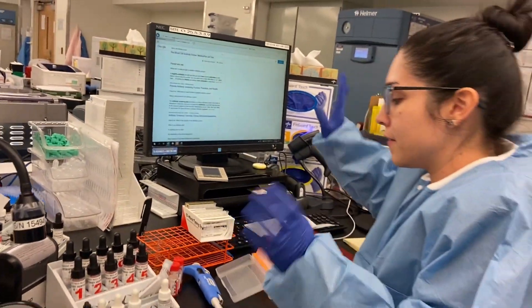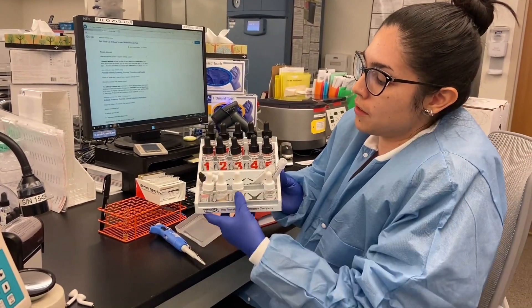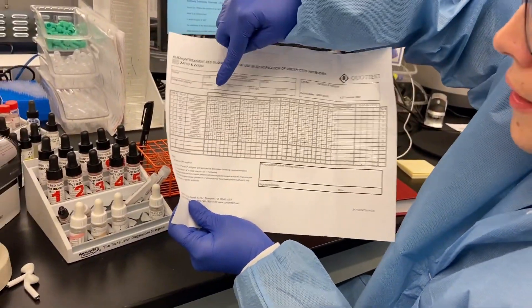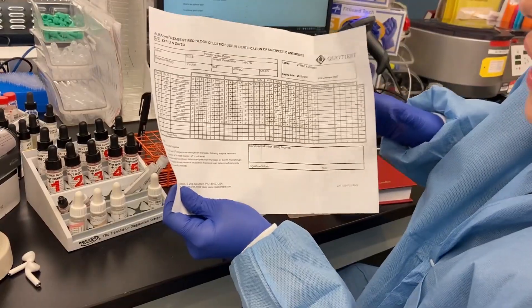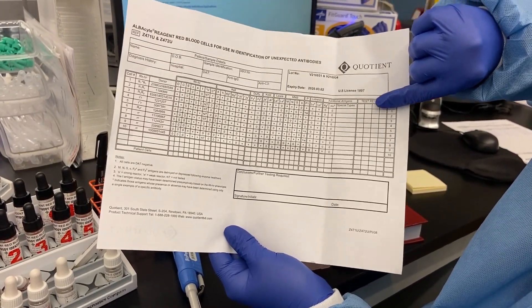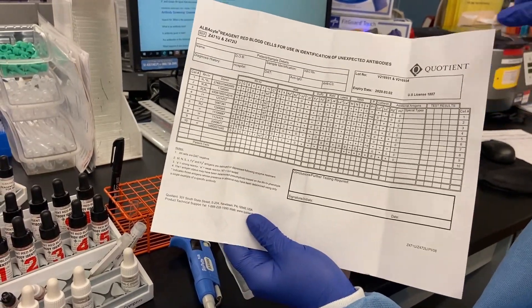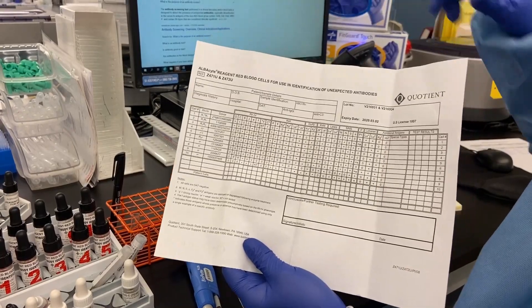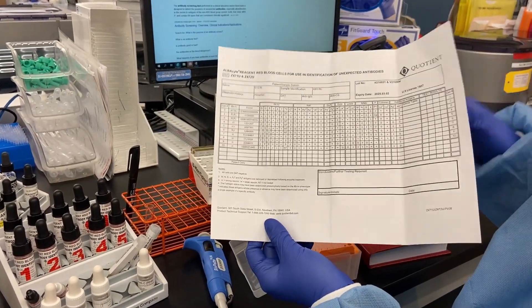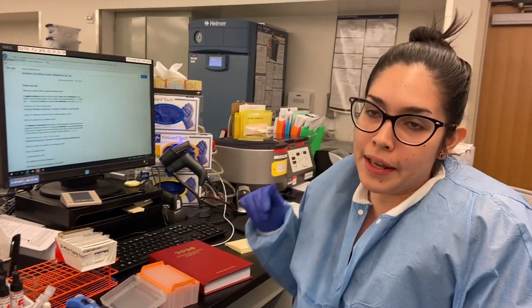If it's positive, you actually have to repeat the process but with 10 different screen cells, which is part of what we call a panel. These screen cells cover all the different blood groups — Rh, Kell, Duffy, Kidd, Lewis — all the possible antibodies the patient might have. We record how positive each reaction is, graded from zero (negative) to four. Then, like a process of elimination — similar to Sudoku — we figure out which antibody the patient has, and then we find red blood cells that are negative for that antibody. It becomes quite complex to find compatible blood when you have a positive antibody screen.